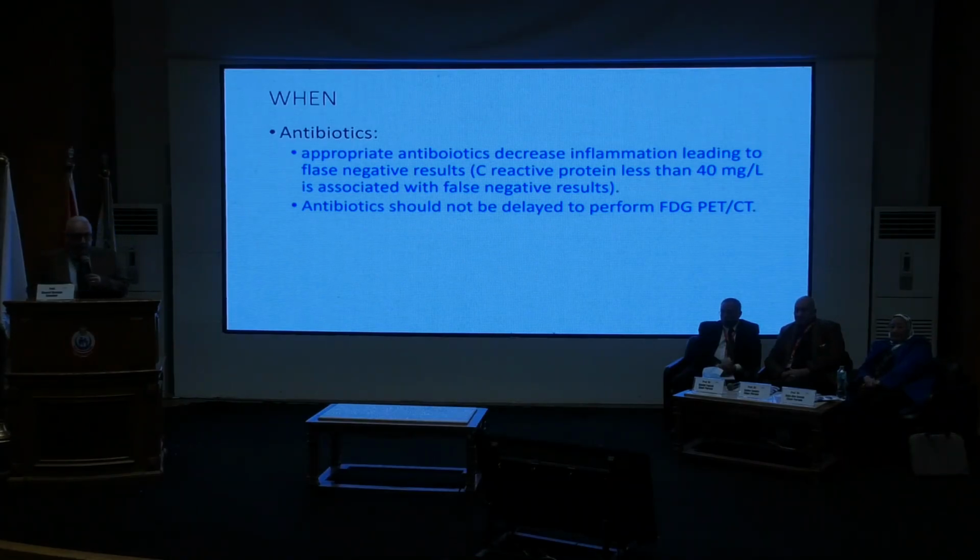When to do the study, after antibiotics or during antibiotics treatment? Can we postpone antibiotics to do the study? The answer is no. We should not do this at all because this is a life-threatening condition. As soon as the physician suspects infective endocarditis, he can start antibiotics. All we can do is to do the study as soon as possible.